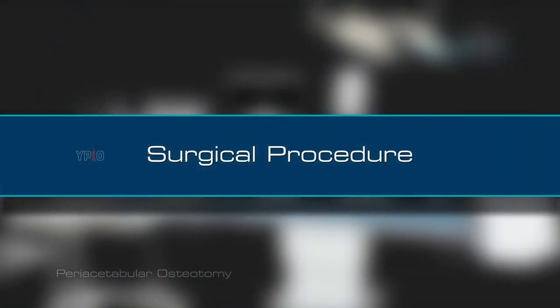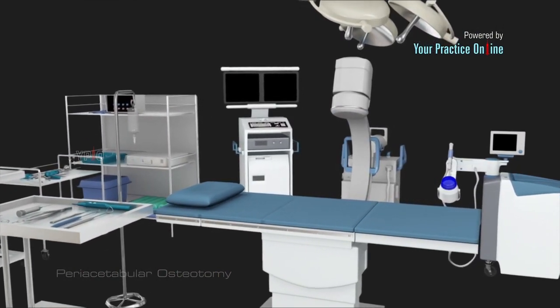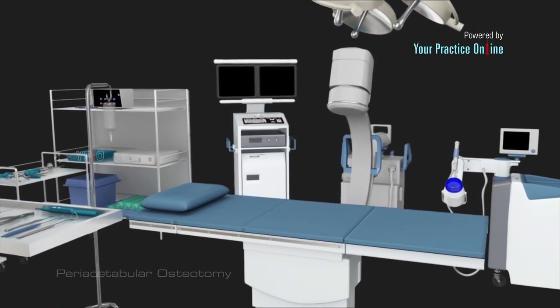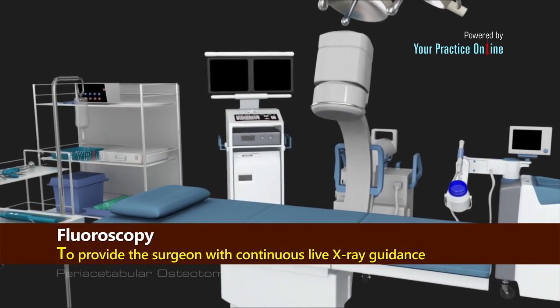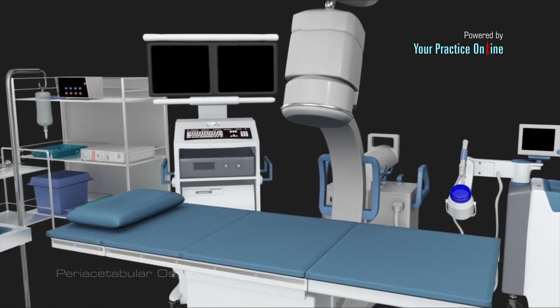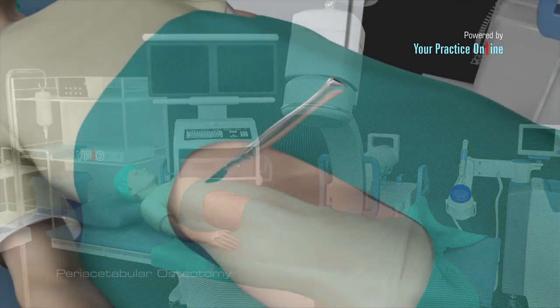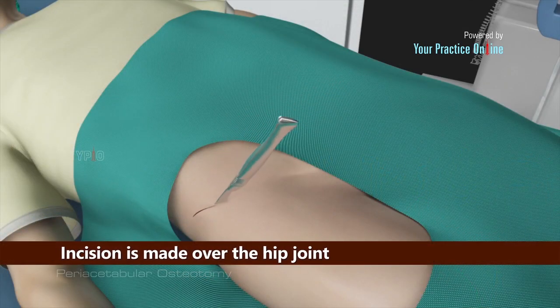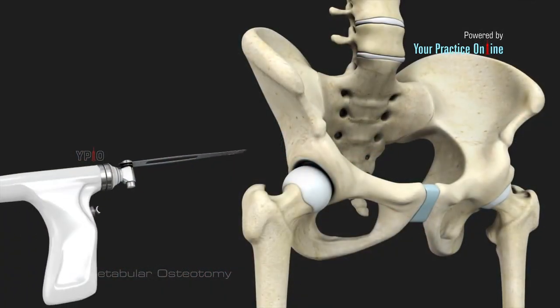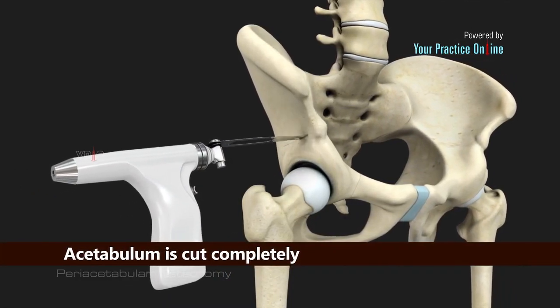Surgical procedure. Periacetabular osteotomy is a technically challenging surgery and is therefore done under fluoroscopy to provide the surgeon with continuous live X-ray guidance. The procedure is performed under general anesthesia with the patient lying on their back. An incision is made over the hip joint. The acetabulum is cut completely from the rest of the pelvis using a surgical saw.